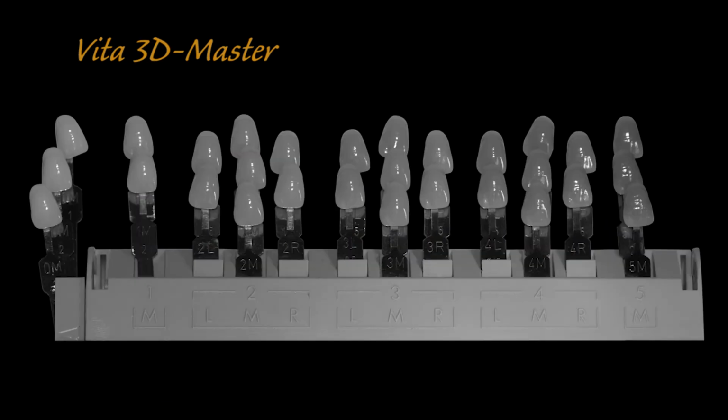This next picture, you're going to see the same shade guide, the Vita 3D Master Shade Guide, and it's grayscaled out. So now you don't see any color. So that takes the element of hue and chroma out. But what does it leave? It leaves value only. Now, value is the most important element of picking a shade.